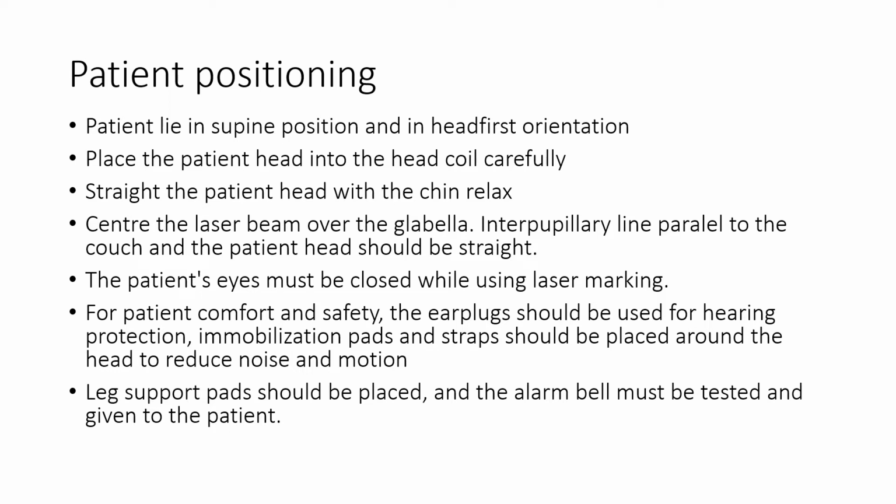The patient's eyes must be closed while using laser marking. For patient comfort and safety, earplugs should be used for hearing protection. Immobilization pads and straps should be placed around the head to reduce noise and motion. Leg support pads should be placed and the alarm bell must be tested and given to the patient.